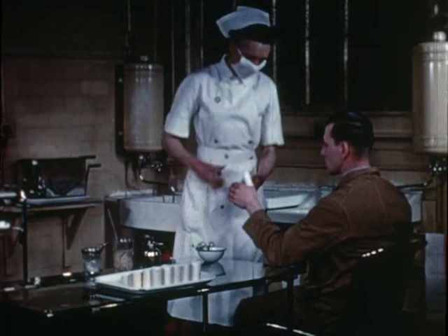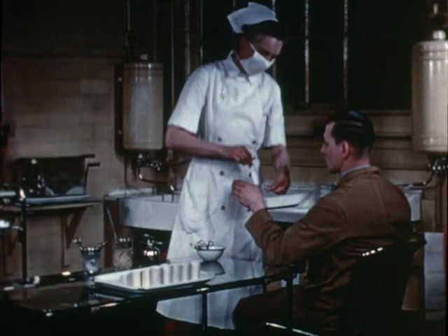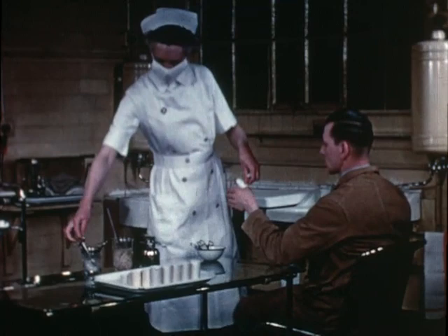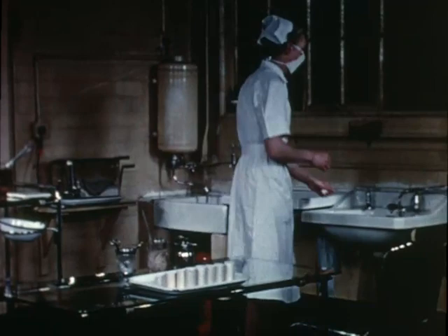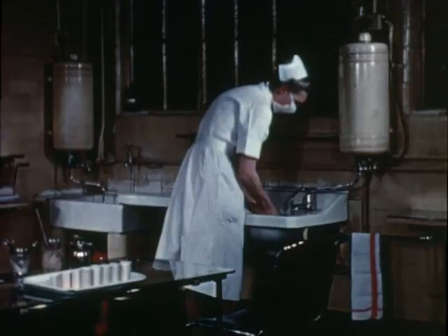Note that the scissors are always kept in disinfectant. The used bowl and forceps are put into the sterilizer for two minutes boiling, and the nurse washes her hands. If during a dressing more material is needed, she must wash her hands before collecting it from the stock table.